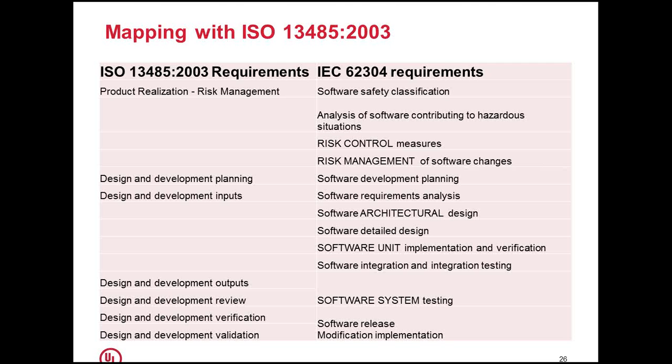All these elements are mandatory in the software development plan. Then inputs and requirement analysis. The standard clearly specifies what you must consider as requirements in software development, how to review these requirements, and how to identify critical requirements. That methodology is also clearly given in the standard.